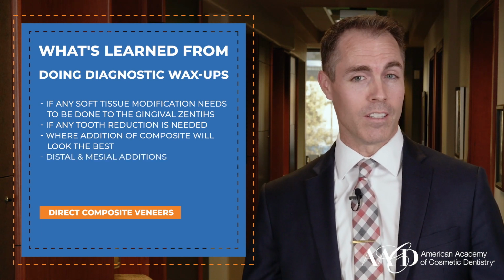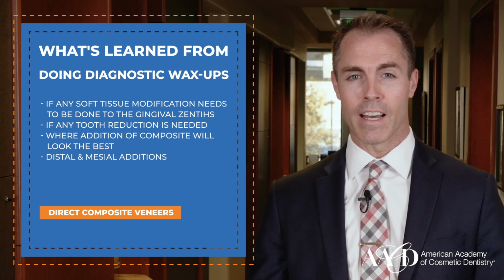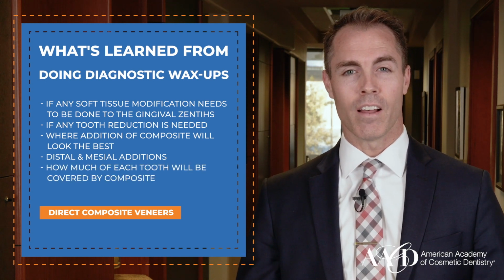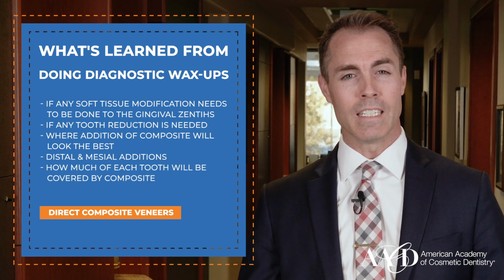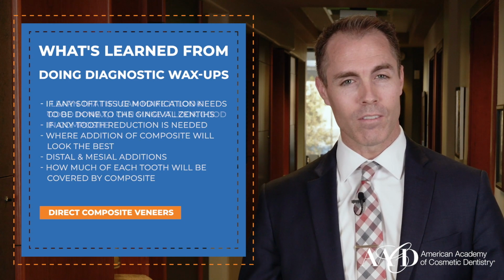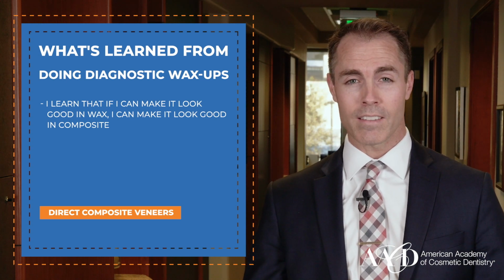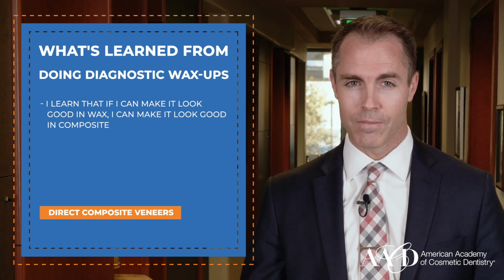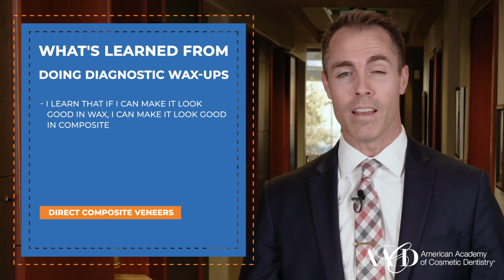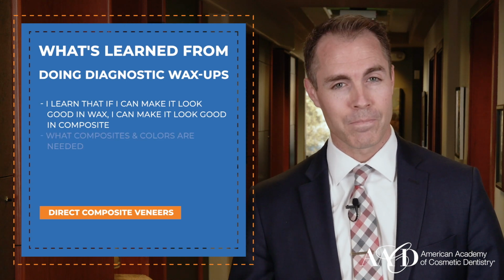Can I add only to the distals of the lateral incisors, or do I need to add partly to the distals of the laterals and partly to the mesials of the canines? I can evaluate how much of each tooth will need to be covered with composite, because not every tooth has to be fully covered. Ultimately, I know that if I can make it look good in wax, I can make it look good in composite. If I can't make the wax-up look good, then there's no way I can magically be able to make it look good in composite. The two go hand in hand.